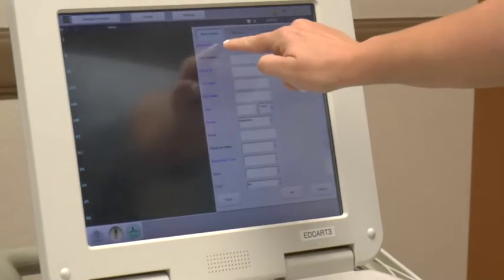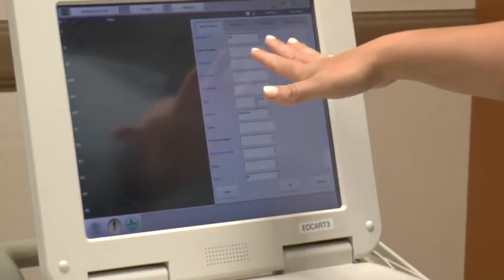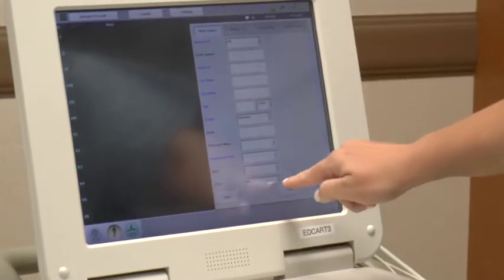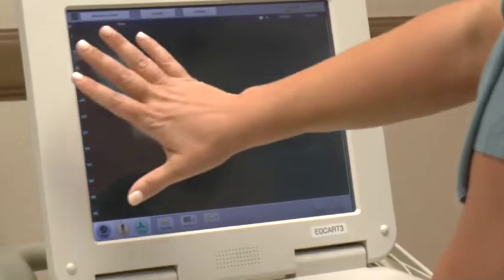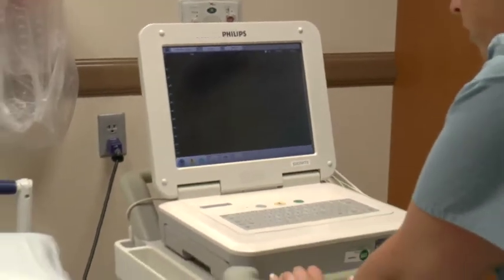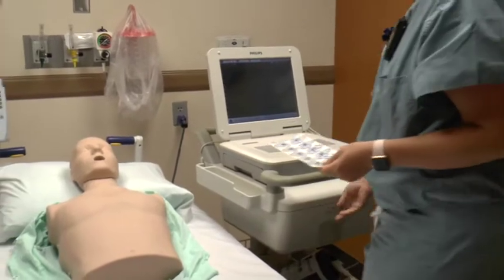Under operator ID, just type in your initials. Everything else will already be filled in once you have an order. Hit okay and it will bring you to the EKG screen. You'll get a set of patches from your drawer — there will be ten on them.